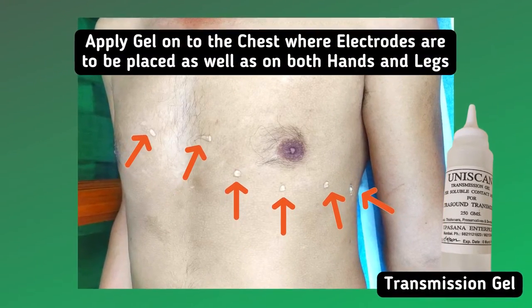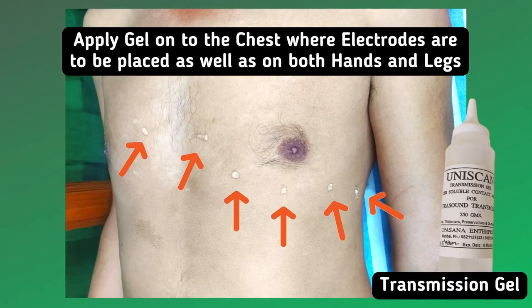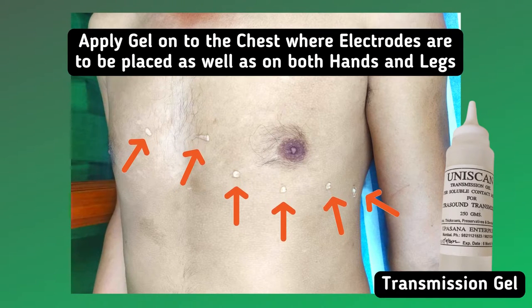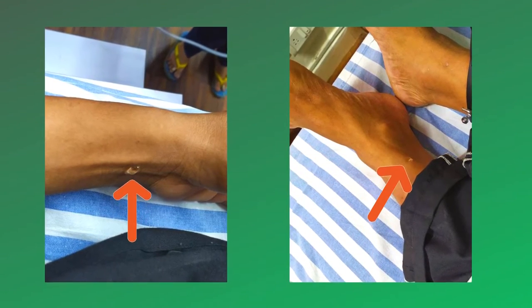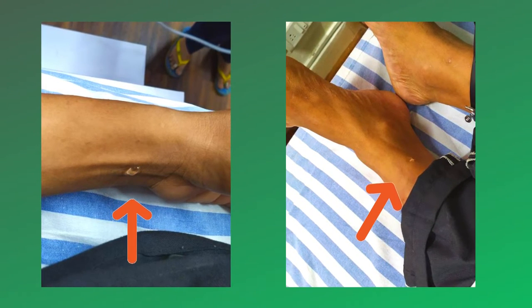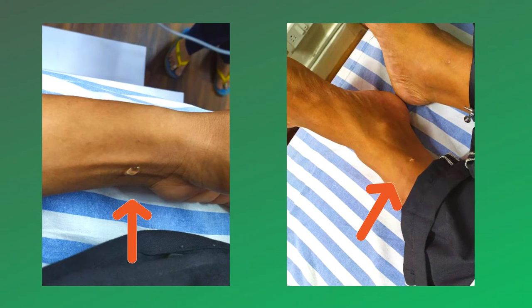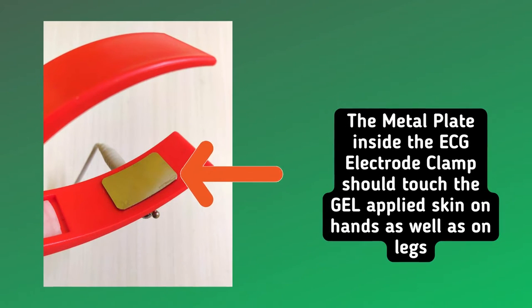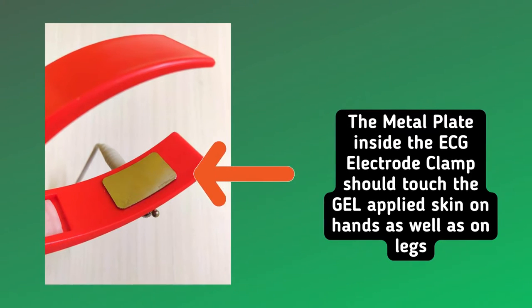Apply transmission gel onto the chest where electrodes are to be placed, as well as on both hands and legs. The metal plate inside the ECG electrode clamp should touch the gel applied skin on hands as well as on legs.